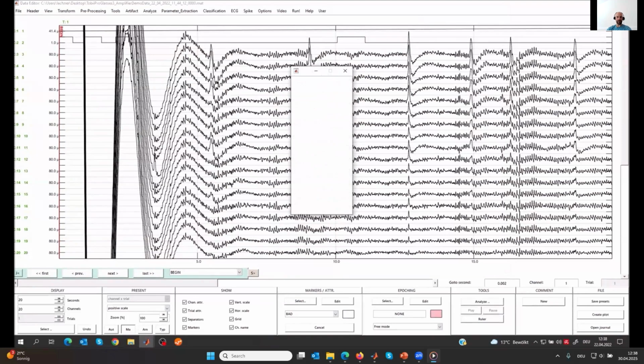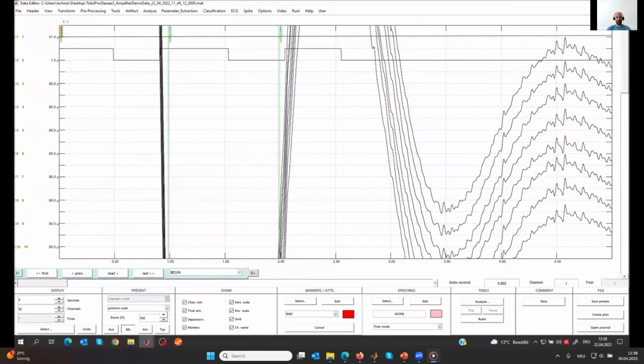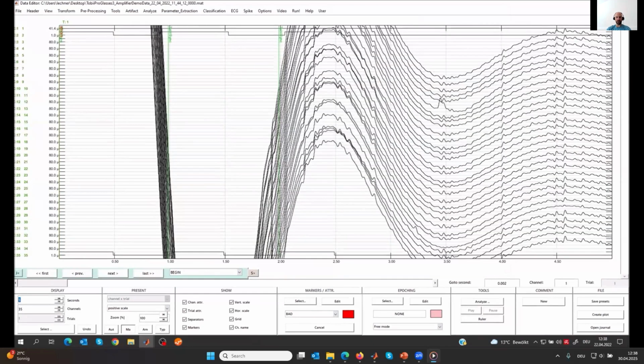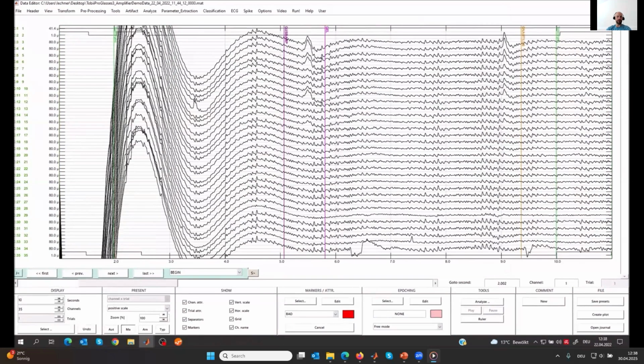In this case it was the last channel, and we select all the events from this file. Then g.BSanalyze imports the event time points and synchronizes them with the EEG. We already see the green lines, which show the Tobii Sync interface event.